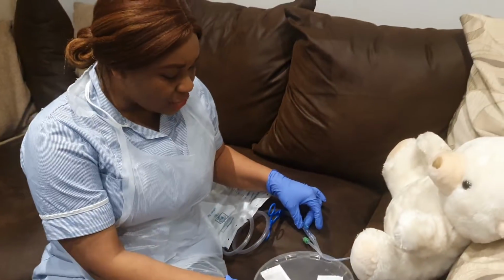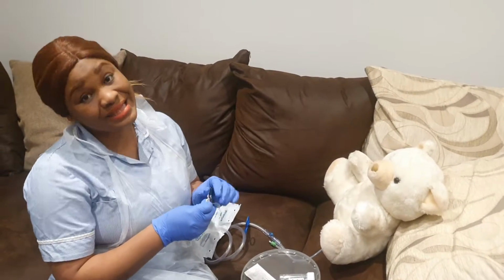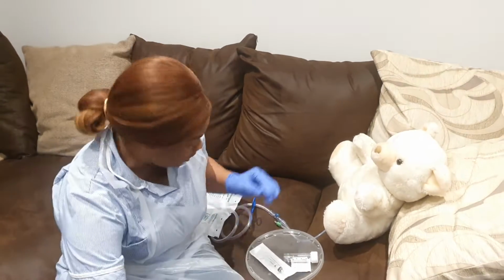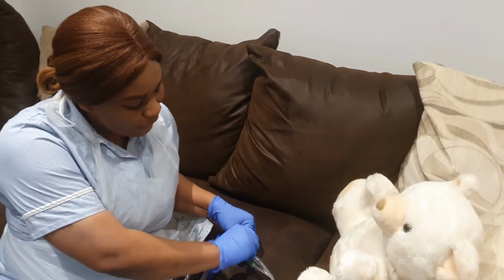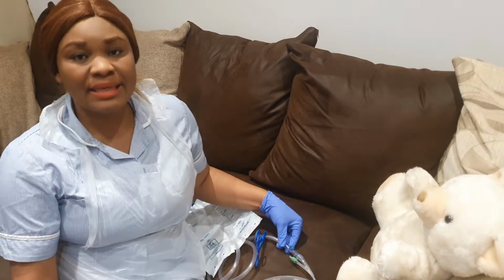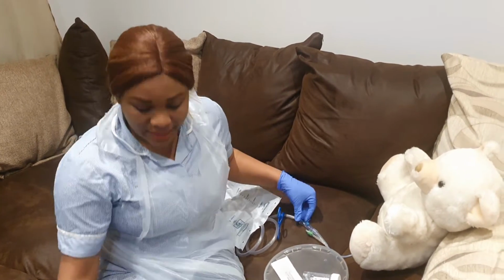All right, guys. So the next thing I want to do, I want to clean my sampling pod. I'll clean my sampling pod for 30 seconds, and I'll allow it to dry for 30 seconds. So I'll clean my sampling pod now for 30 seconds. 1, 2, 3, 4, 5. And I will allow it to dry for another 30 seconds. 1, 2, 3, 4, 5. That's 30 seconds.